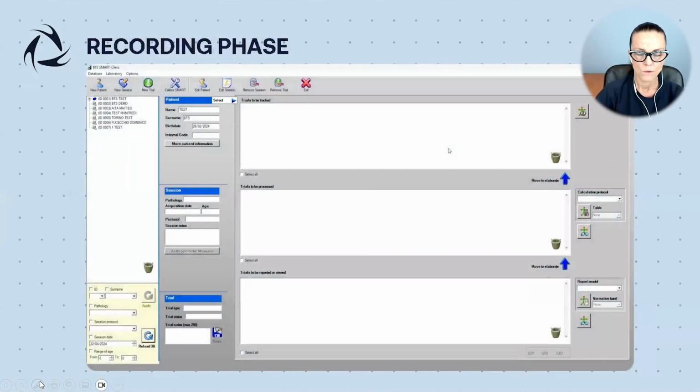Okay. When the patient is ready, we can start the real acquisition with the BTS Smart System. This video is going to explain all the steps to do by using the Smart Clinic software interface. Okay, enjoy the video.